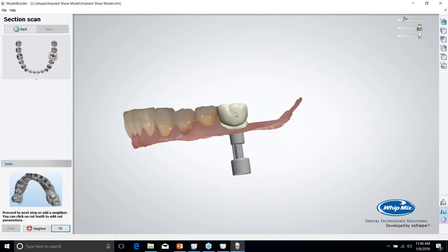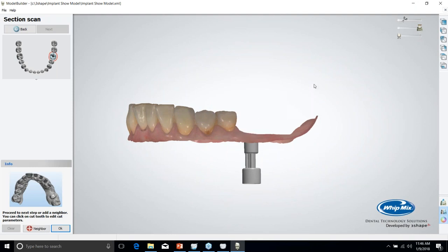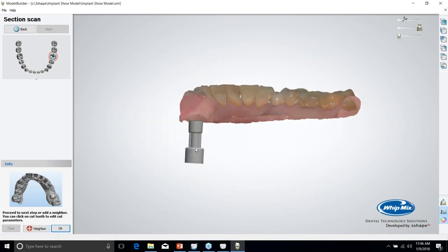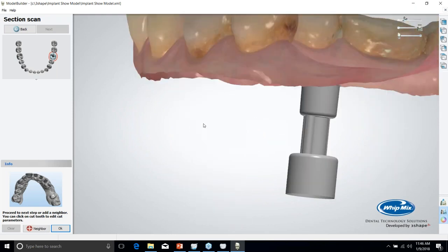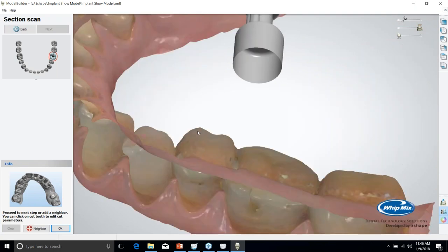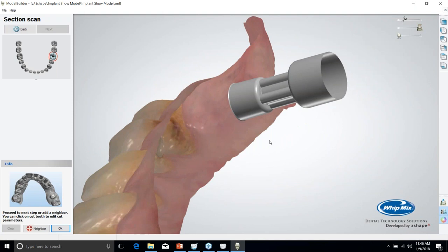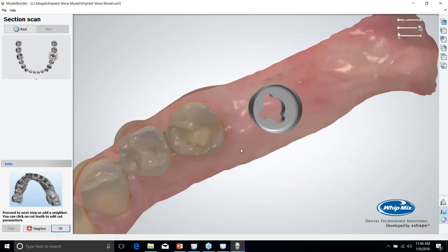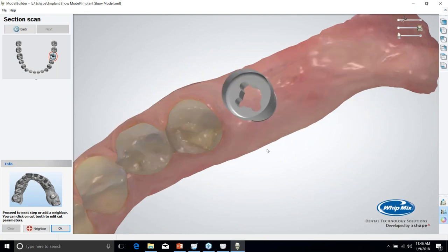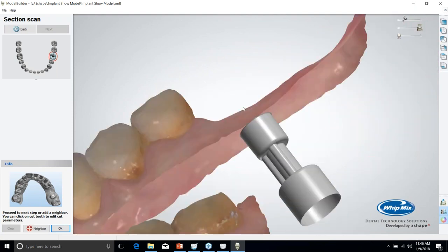And so you can see here, it's pulled in my restoration. I'm just gonna hide that real quick. And then you can see NT Trading does make printed model analogs. So if you have a company that does make the analogs, what it's gonna import here is a kind of a shell profile of what the channel needs to look like for that analog. And so NT Trading uses a two-piece indexed screw together. So it has a nut that screws from the bottom side, analog, and they're actually reusable if you want to reuse them.